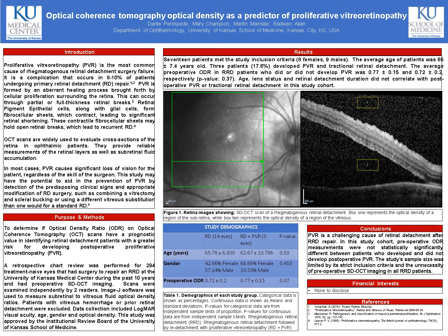The order of diagnoses and treatment that was required was to have a rhegmatogenous retinal detachment followed by an OCT scan, followed by repair of the retinal detachment, and then with a complication of PVR, of which 3 patients of the 294 met. This lack of an N did not give enough power to the study.